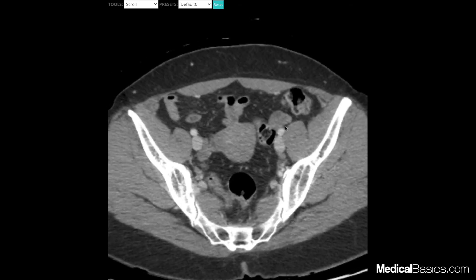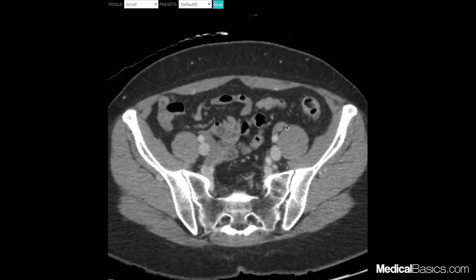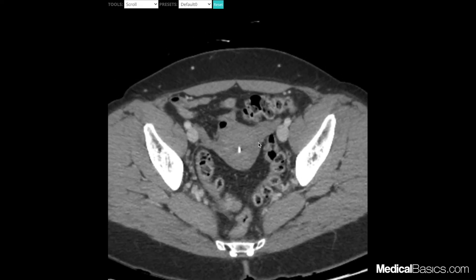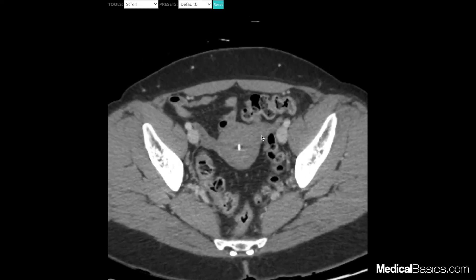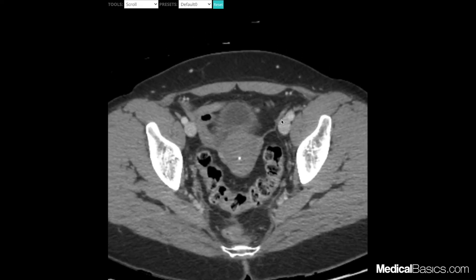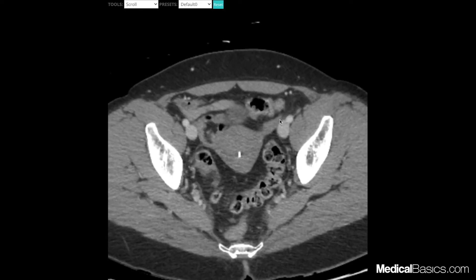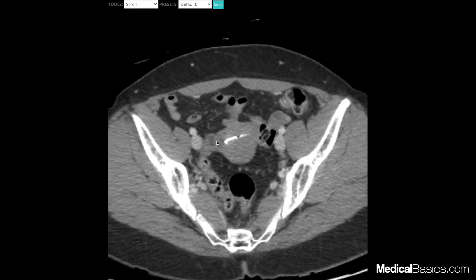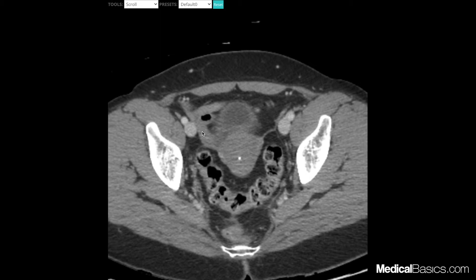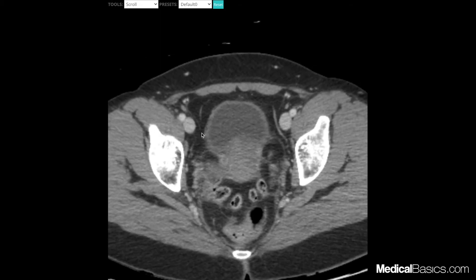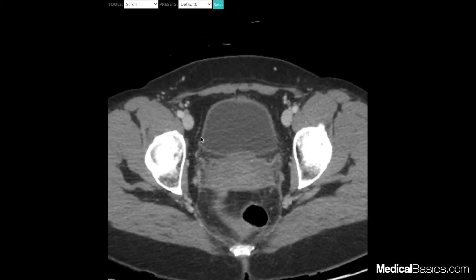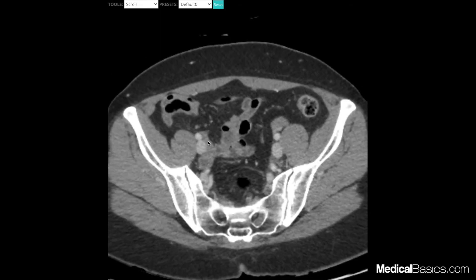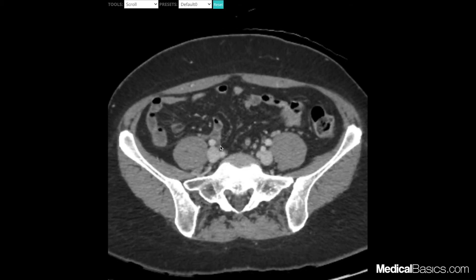Our uterus is right here. The ovaries are going to be these guys — they come off and kind of drape over our iliac vessels. So this is our ovary right here, it kind of comes out like arms. And on this side, it's going to be that right there — almost looks like small bowel, but if you follow it, it's not going to connect with anything else.